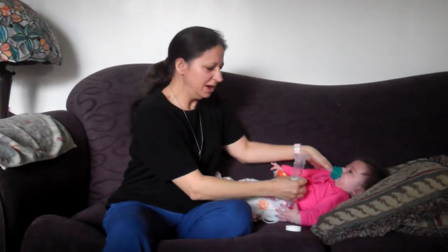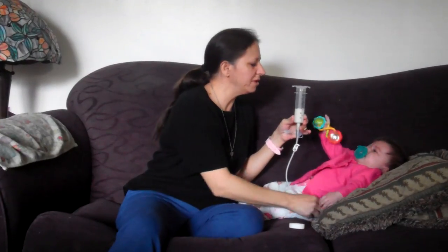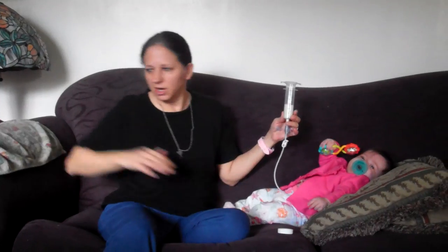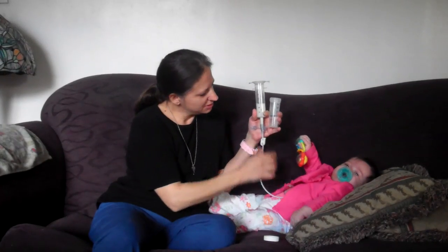I'm going to scoot her back up. There you go. She never likes that, but it's better for her to be upright as much as she can. When I feel that she's relaxed, Hannah baby.